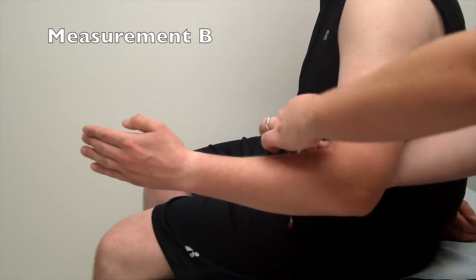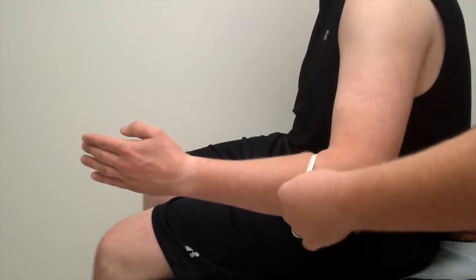Measurement B. Locate the largest point of the forearm and take a circumferential measurement at this point.